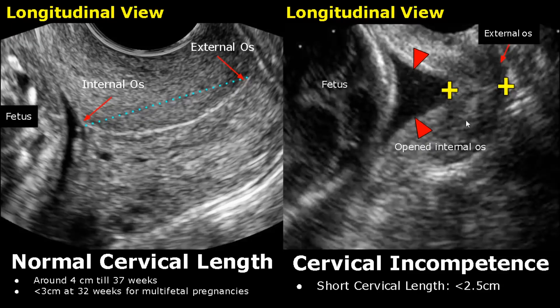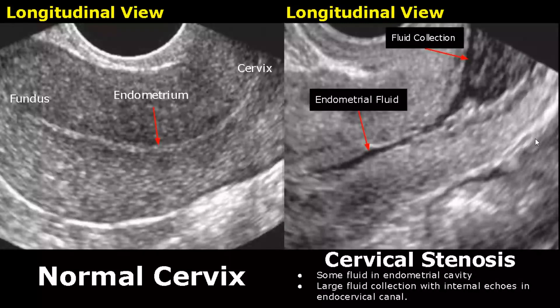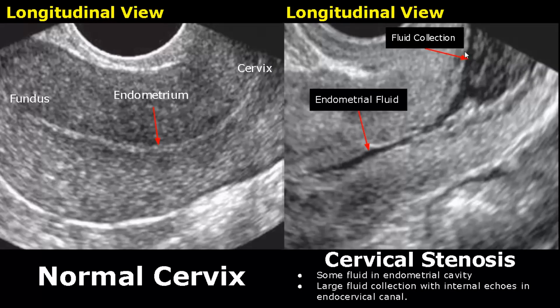Visually, we can see that the cervix here is much shorter than the cervix in the normal image, and this is the fetal head. Cervical stenosis is the abnormal narrowing of the cervix. On ultrasound, it is difficult to diagnose, but we may see some endometrial fluid and a large fluid collection with internal echoes in the endocervical canal.